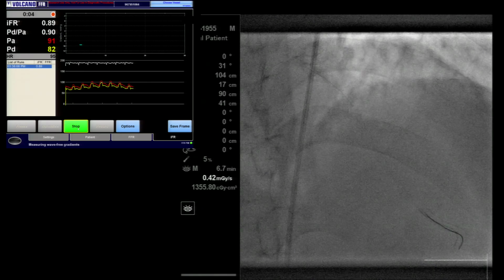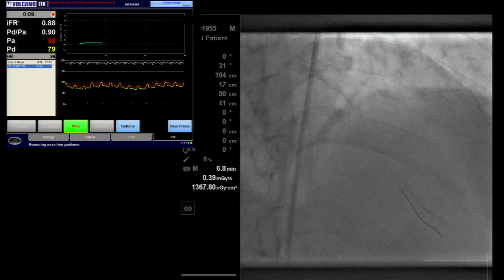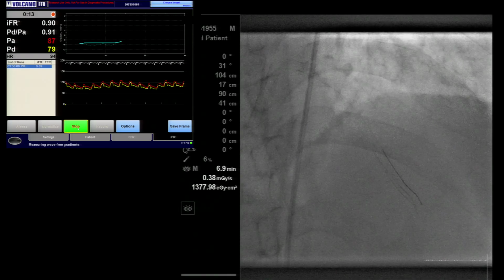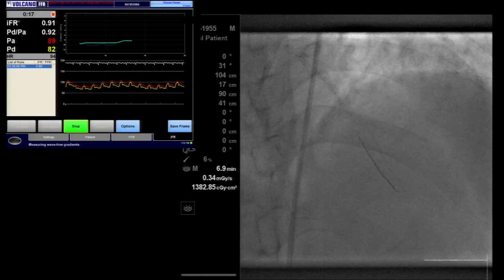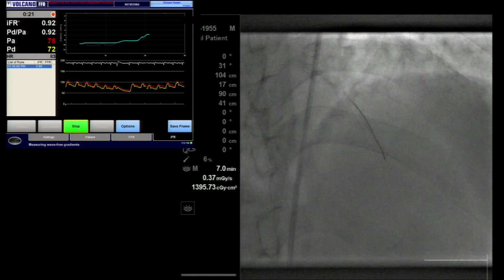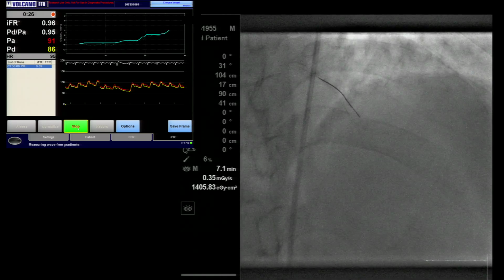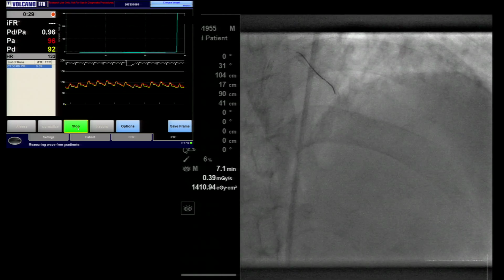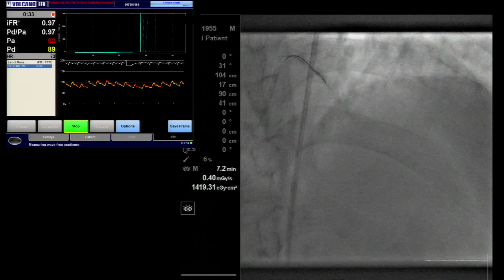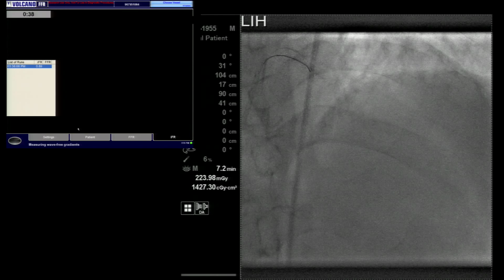Okay, so I'm going to give you the fluoroscopy at the same time, and I'm going to do it very slowly, just by hand, and we're watching the screen very carefully. Where there looked to be a bit of a stenosis was around here, and then this part is after the stent, but in a normal-ish looking vessel. And here we are now going into the stent, and then we are going up to the top end and back into the left main stem. Okay, good. So if we stop recording there, that's great.